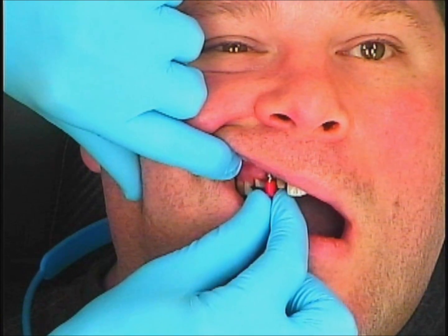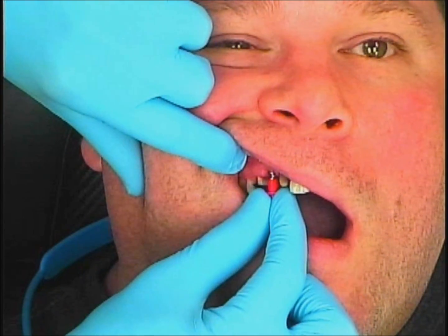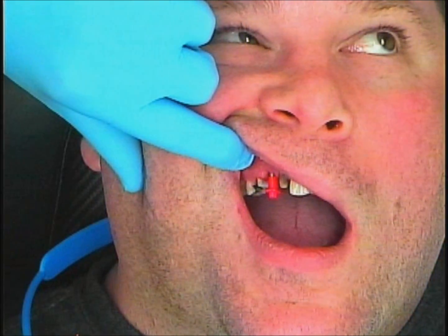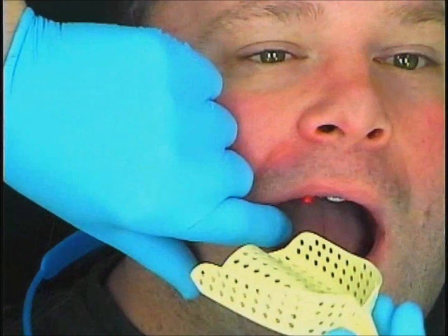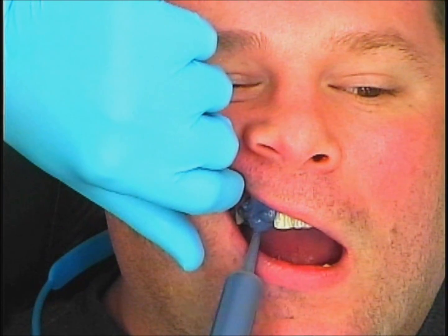Now it's only going to fit one way. This particular cap which gets picked up has two retentive wings. If you find that those wings interfere with the adjacent teeth, just simply unscrew the impression coping and twirl it around a bit until it seats in another position and you'll be good to go.